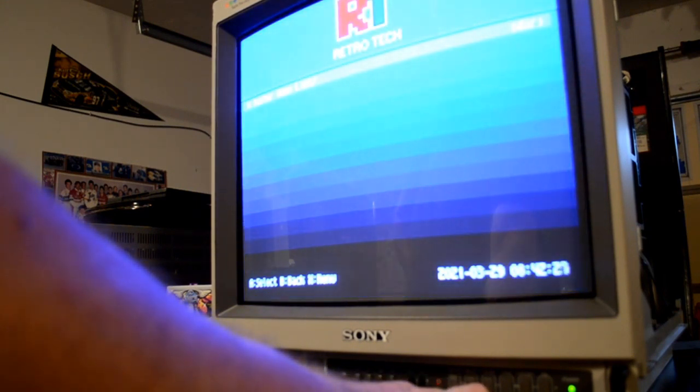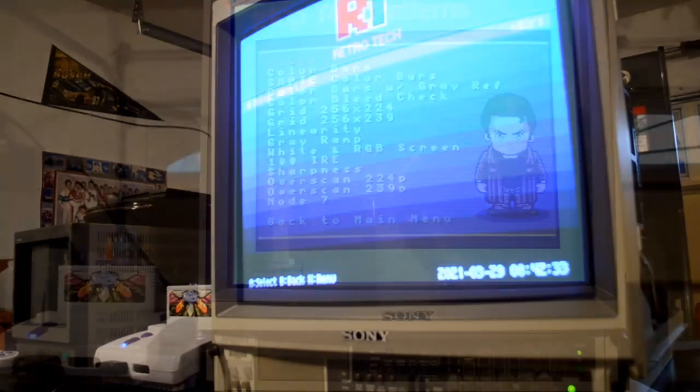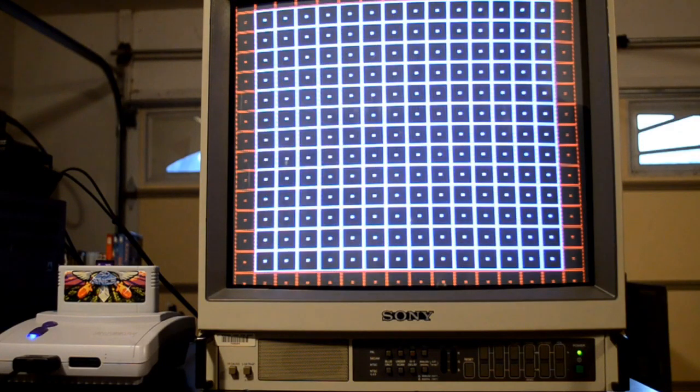Next, I want to show you some RGB. We'll do some before and after screens here on how this came out as far as the look of the screens before any kind of calibration adjustment. And so we're looking at just grids and other patterns to see what our screen looks like, again, prior to me going in and making the geometry adjustments.